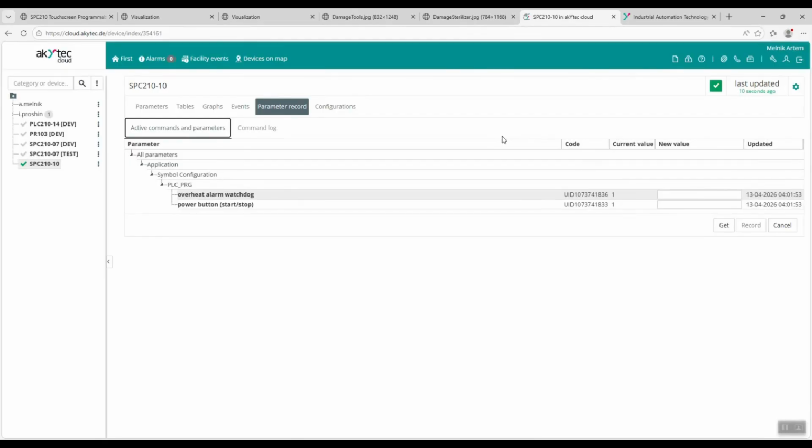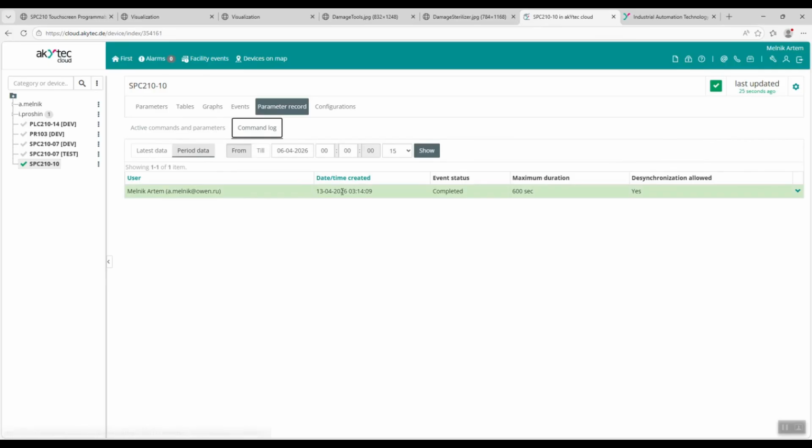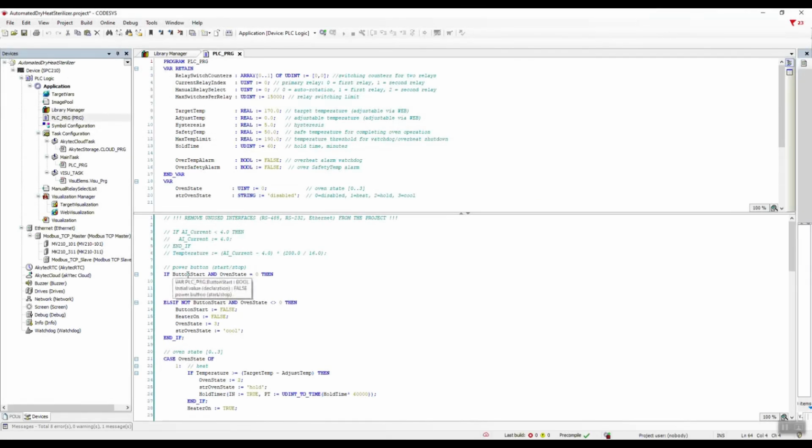We send this alarm to the cloud service of akYtec in read-write mode, so that only the operator can reset this alarm after analyzing the abnormal situation and making corrections to the causes of the sterilizer malfunction. When this alarm is reset, a record remains in the cloud service history with a timestamp of the alarm reset and the name of the responsible operator who performed this operation. And, obviously, we need to fix the flaw in our sterilizer algorithm. When manually pressing the main start button for the sterilizer, we also need to check if this specific alarm is active. Only in the case where this alarm remains false will we proceed with the next step: switch the sterilizer to the heating state.